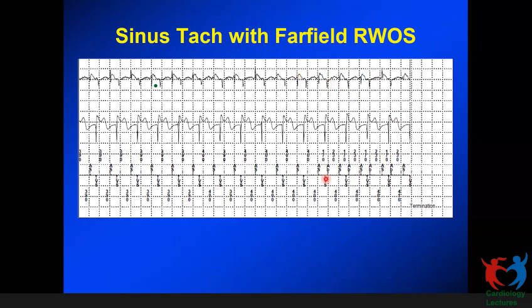Right? Ideally, we don't want this. If we allow the pacemaker to see this all the time, now for the pacemaker, this is a probable atrial tachyarrhythmia, and then the device will behave slightly differently than how it behaves in a dual chamber mode. So this is what is called far field R wave oversensing. That's a little bit of a nuanced difference. One is a pacing spike in one chamber being sensed in the opposite chamber, which is technically a crosstalk, and intrinsic activation sensed in the opposite chamber is called far field sensing.